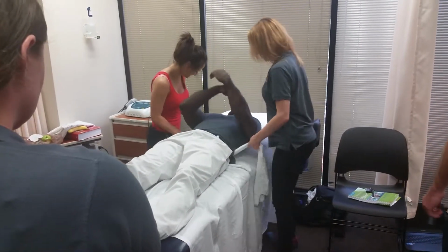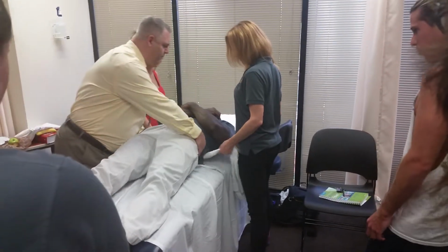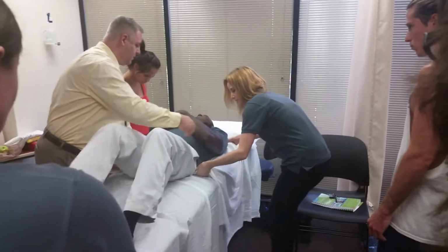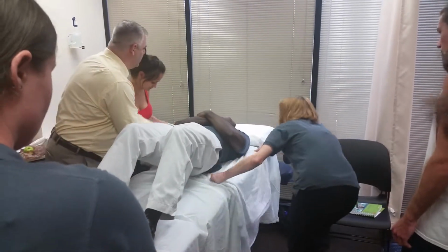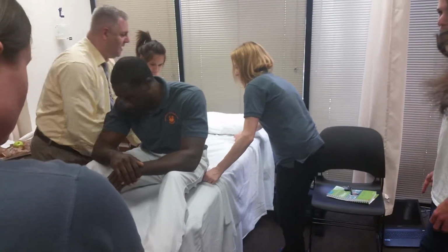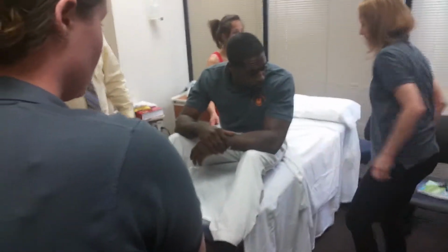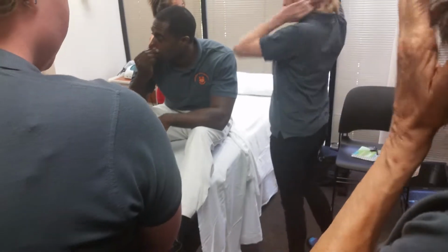Shouldn't that towel be underneath his hips also? Yeah, bridge up, just bridge up. You're dragging his head again. Like Mike says, it happens all the time. You've got to roll them to one side, then roll them back, grab it, roll it back up, and then redo it.